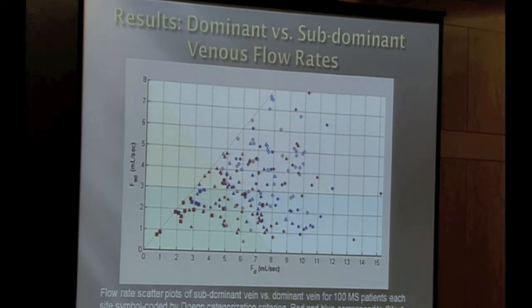And if we look at that ratio from the craniectomy study that said it may be dangerous if you have more than 3-to-1 ratio of dominant to subdominant flow, and that's this purple here, and again, they're almost all solid, those are the areas of highest risk. So here you have a very nice data set that shows in all of those risk factors, those are the ones that likely have structural abnormalities.